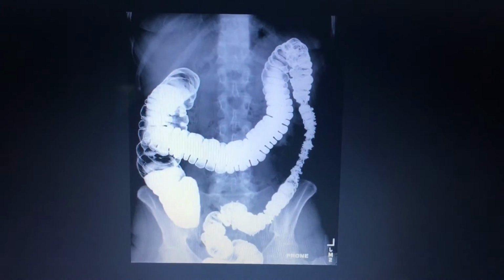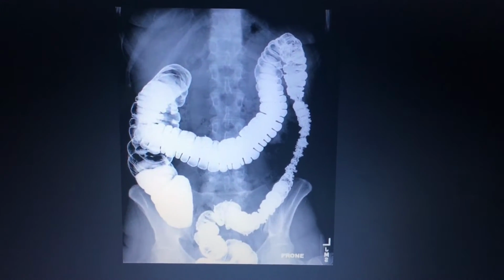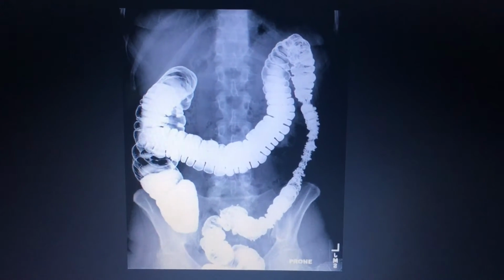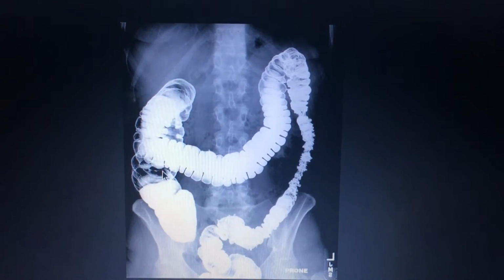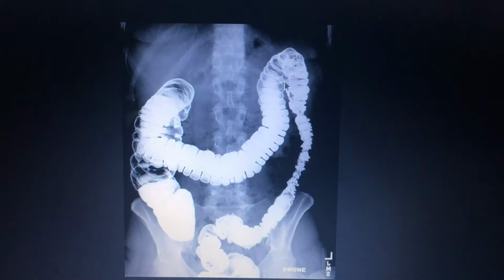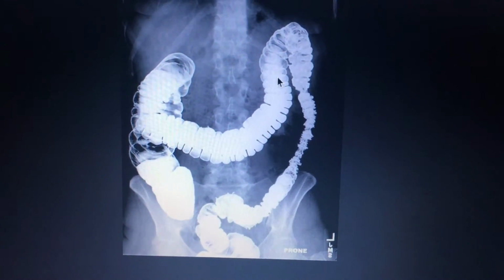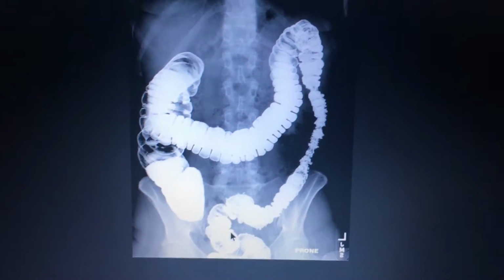This would be the PA. This is after the retrofilling of the large colon. This is after the radiologist has done his exam. As you can see here, we got a double contrast going on here. We got air or CO2. We actually used air. And then the barium, which is the white. This is the cecum. This would be the ascending, transverse, descending colon, down to the sigmoid and the rectum.